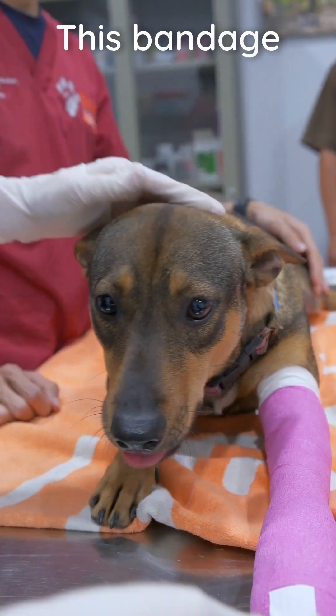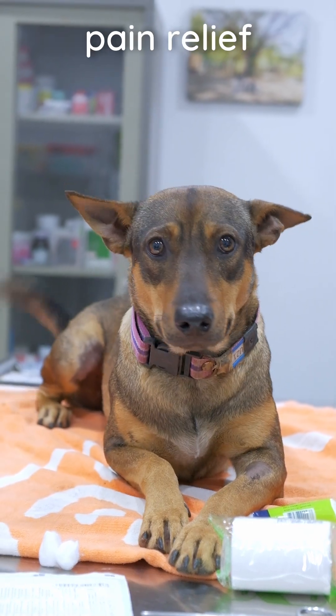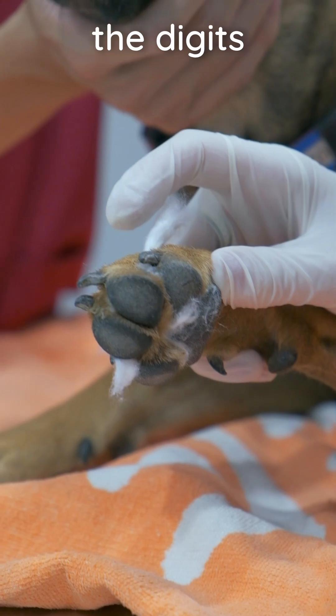How to place a simple leg bandage on a dog. This bandage may be used for wound dressing or other simple injury. Ensure adequate pain relief is on board. Cut the nails if needed and place a small amount of cotton wool between the digits for padding.